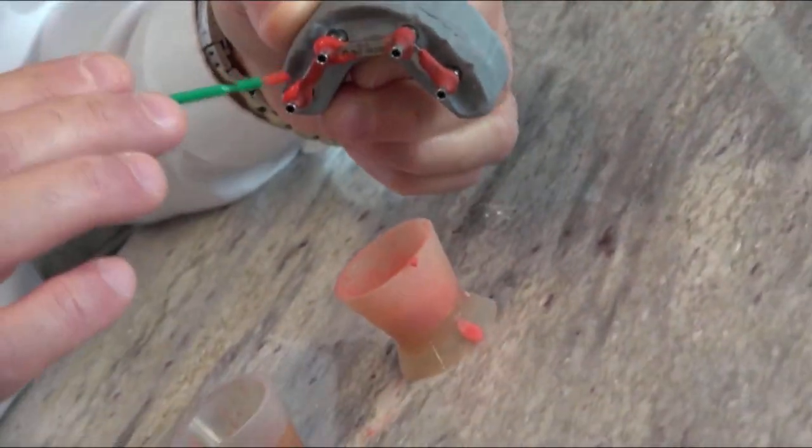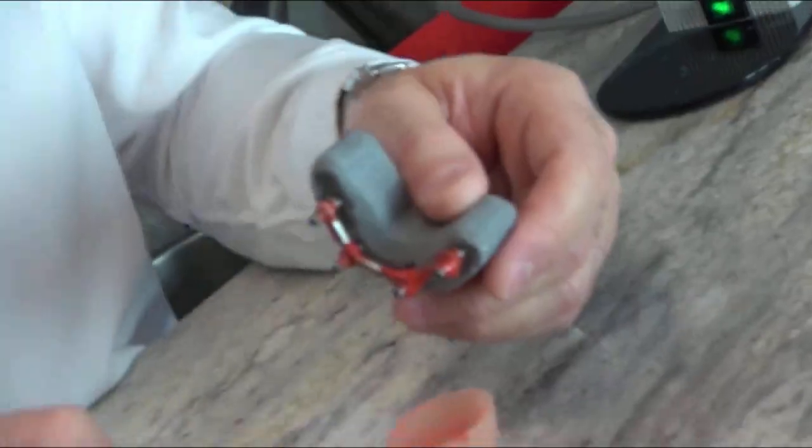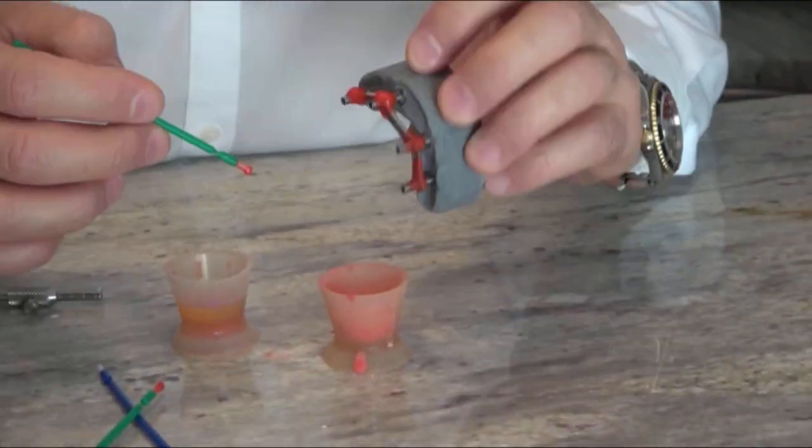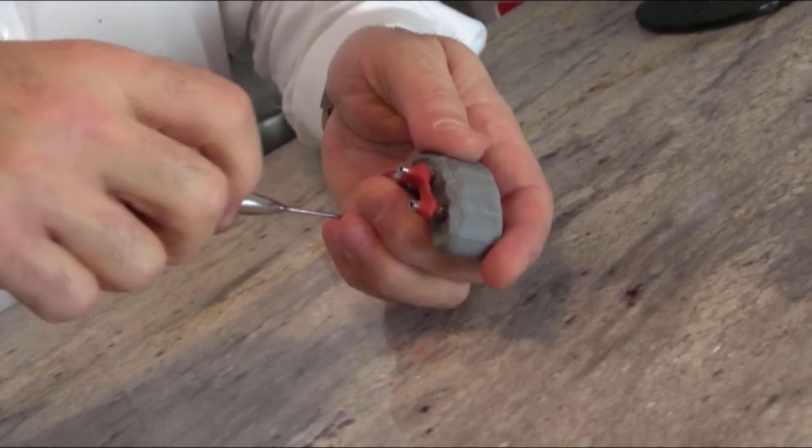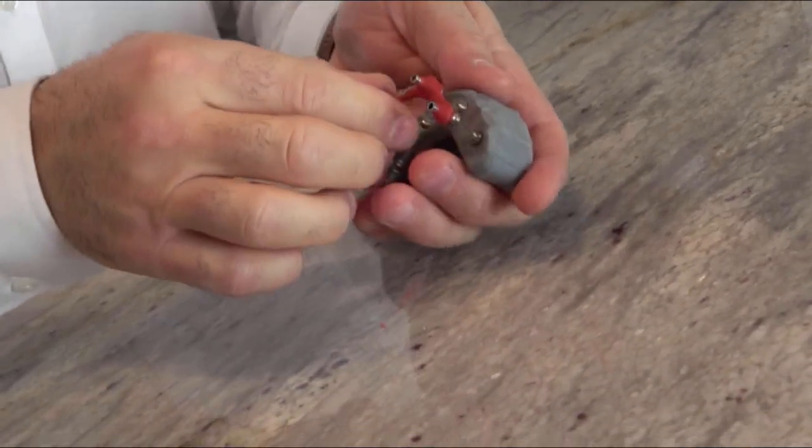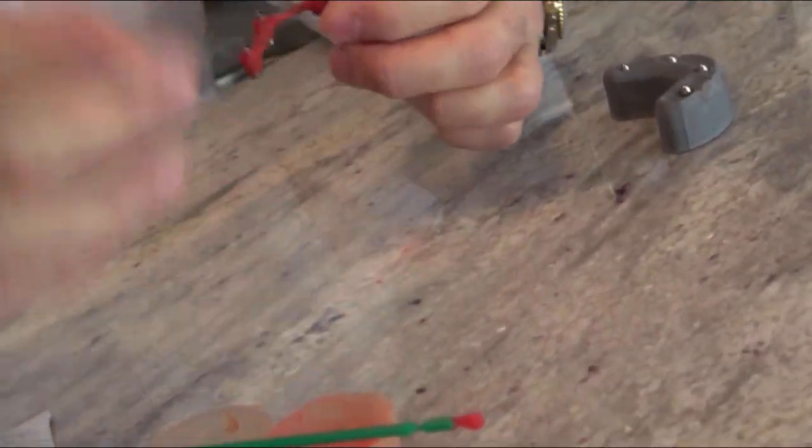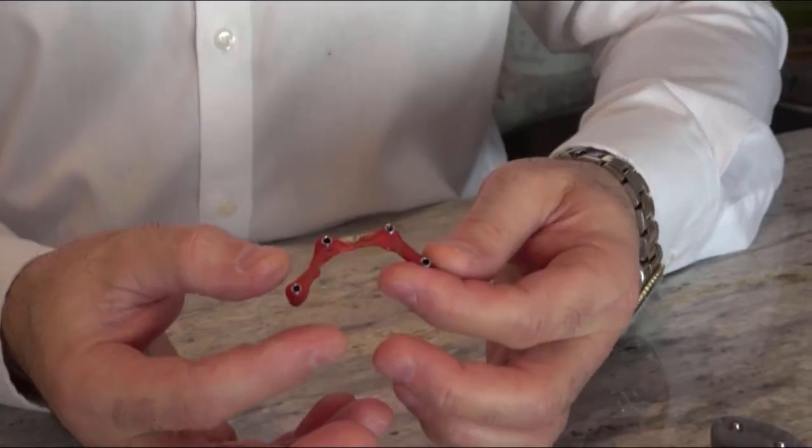Make sure everything is set all around. Then unscrew it from the mouth, just like I do on this model. Make sure the screws don't get lost. Here's the test - this is crucial. Once you take it out, make sure nothing moves.